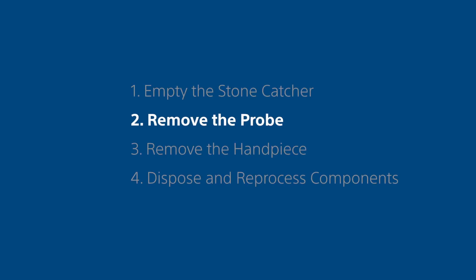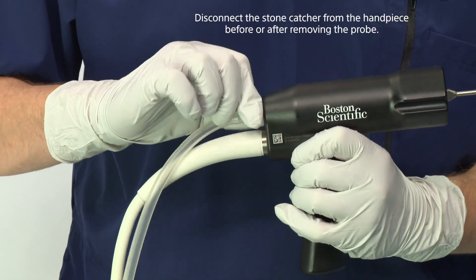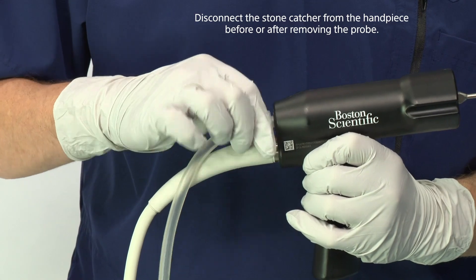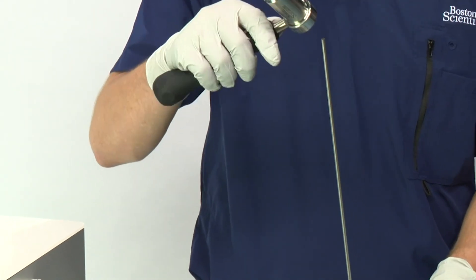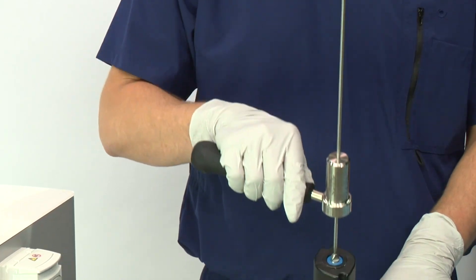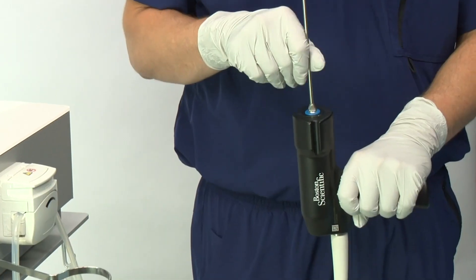Step 2: Remove the probe. Disconnect the stone catcher from the handpiece. Loosen the probe from the handpiece using the torque wrench and then remove the probe.